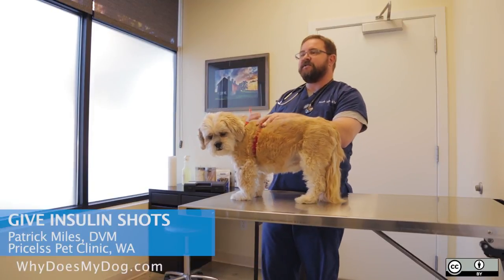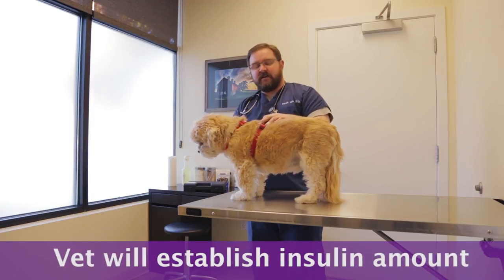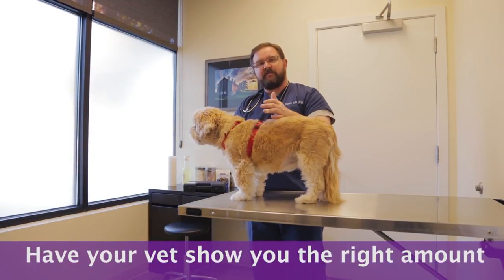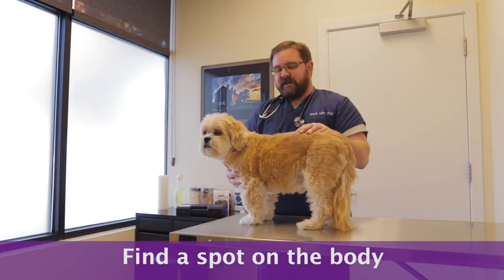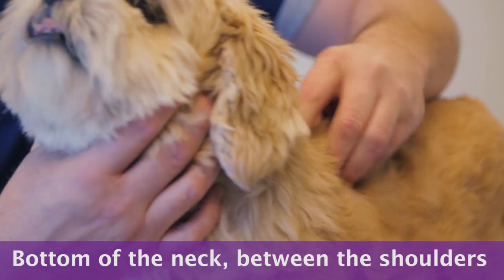In general, once we've established what dose of medication we're going to be starting our patient on, we'll help you recognize with the syringe what the appropriate increment and the appropriate amount to be drawn up is. And when we're giving the insulin injections, we're going to find a place on their body that we can elevate up their skin a little bit to help guide where the needle's going to be going.